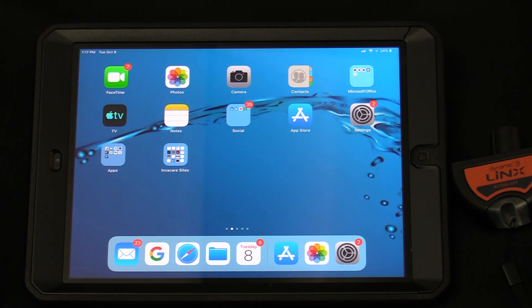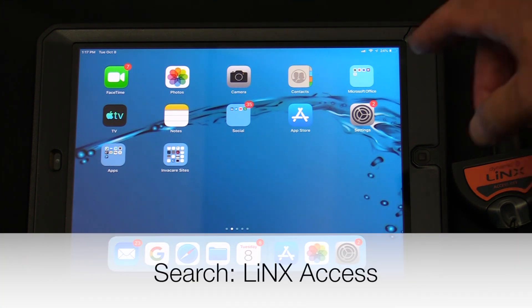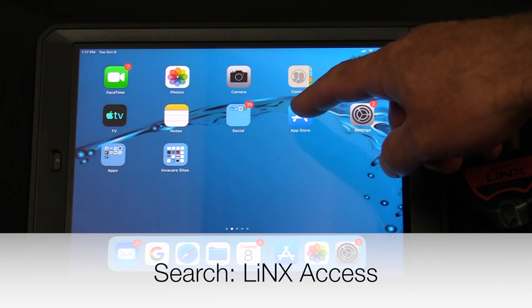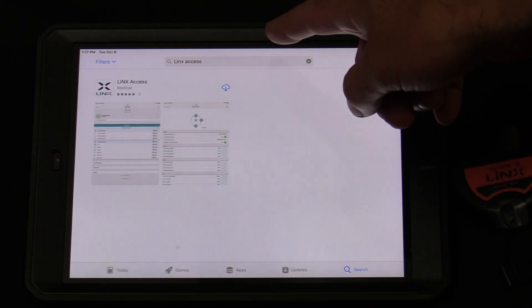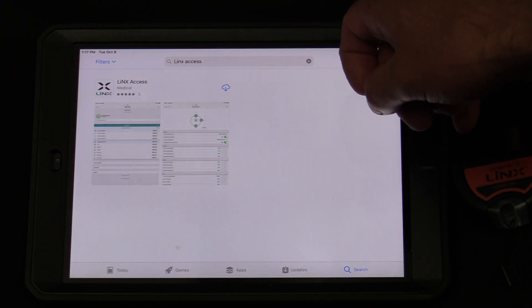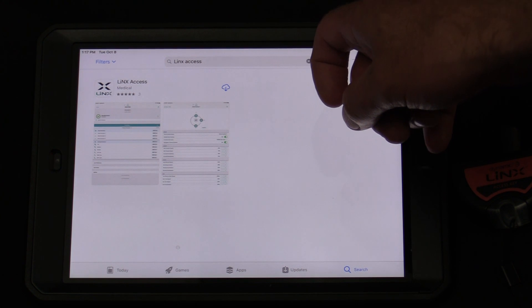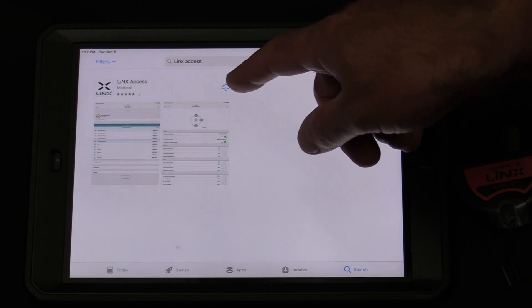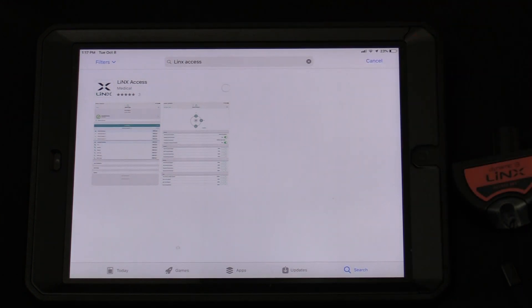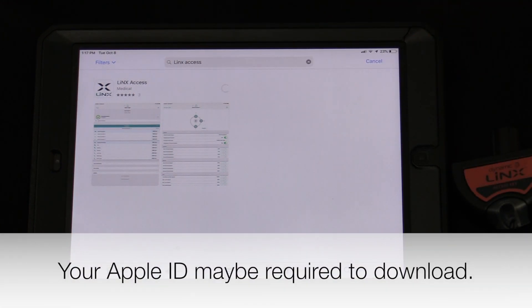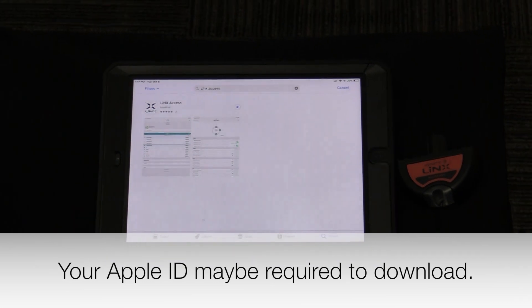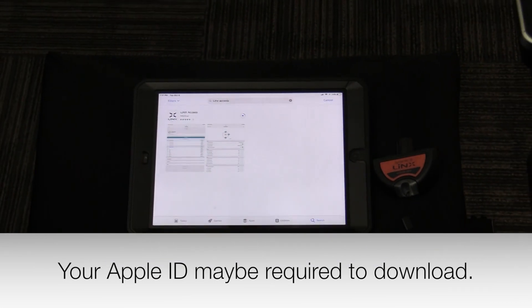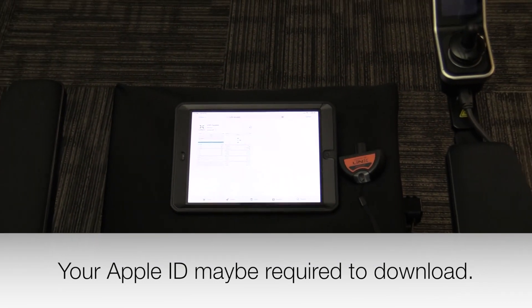Next, we will go to the Apple Store and search Lynx Access. We will open up the App Store, type in Lynx Access, and once the app appears, we are going to install. Your Apple ID may be required for this free app.